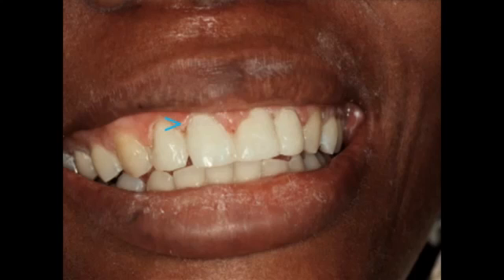Because when I put pressure on this custom matrix, it also put pressure on the gingiva around the necks of these teeth. That composite, instead of going subgingival, is supragingival. It's easy to finish off this composite. I use a 7901 carbide finishing burr to remove that composite that is flash, and this patient is going to leave the operatory looking better than when she came in.